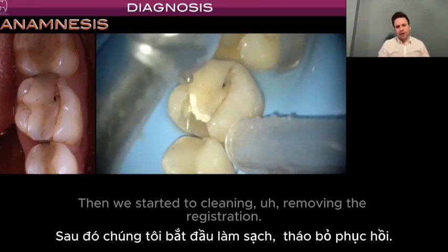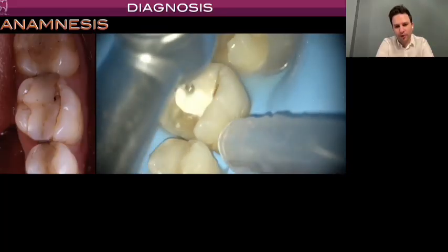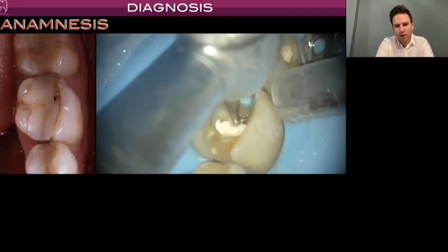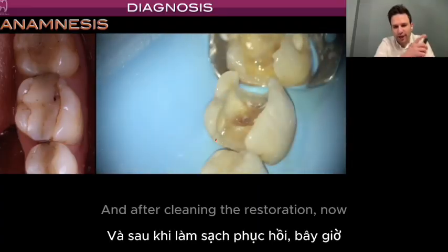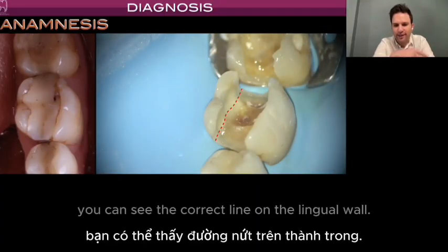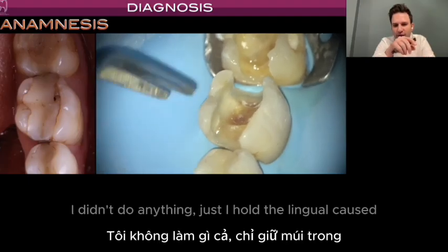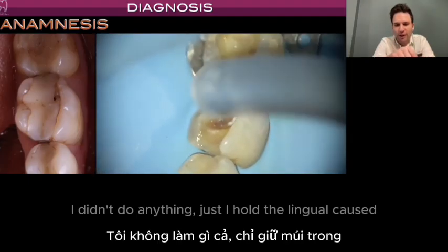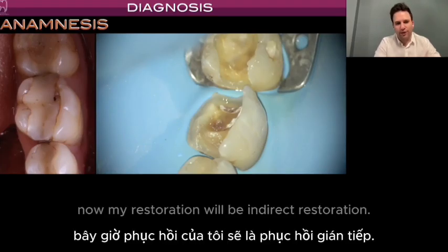Then we started cleaning, removing the old restoration, and after cleaning, now you can see the crack line on the lingual wall. I didn't do anything, I just held the lingual cusp with tweezers.